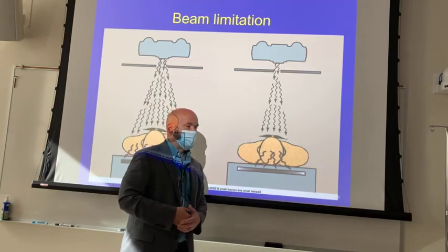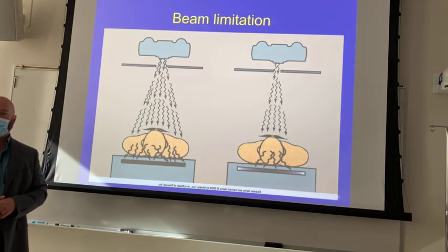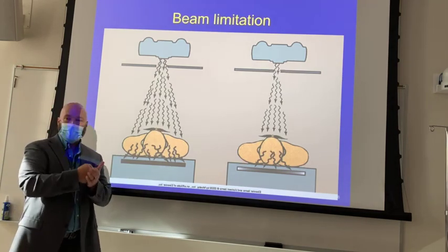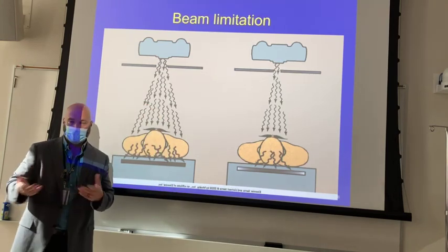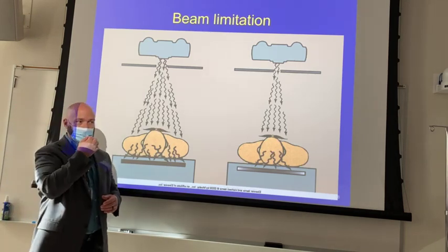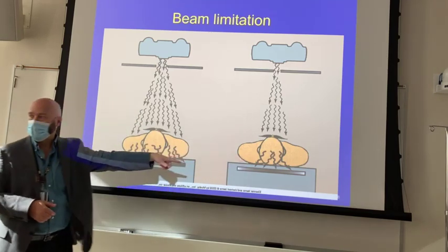What are most of the photons that are going to come through the patient going to be? PEs. PEs stop inside of the patient. That's photoelectric, that's what stops inside of the patient. There's going to be some penetration, that's probably what you were thinking of, right? But what are most of them going to be? Somebody that thick especially is going to be Compton, right?